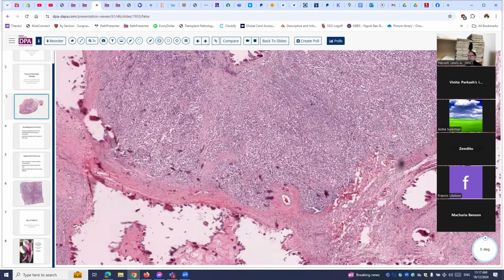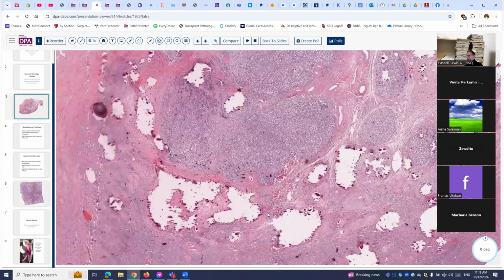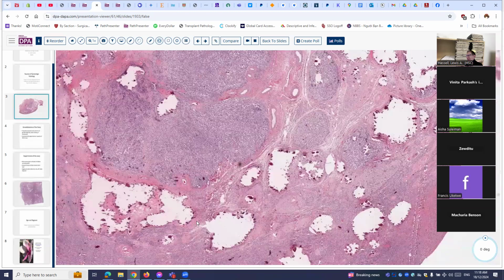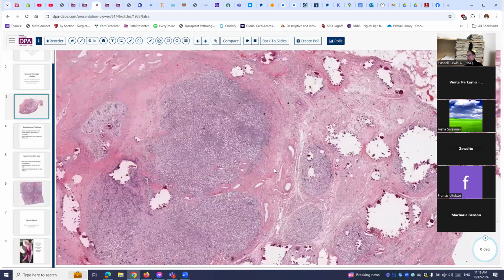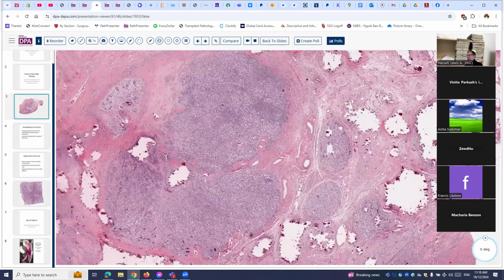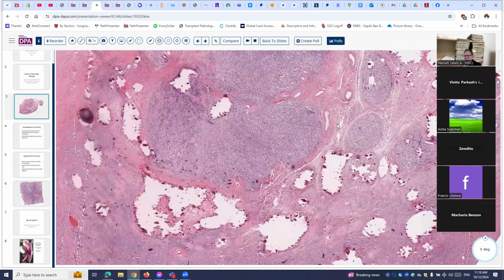Yes, you are right. That's the history. Now it's coming back to me. It looks a lot like dysgerminoma, that's all dysgerminoma, but I was thinking that the gonadoblastoma often calcifies, and so finding a viable tumor is often a challenge. So I was thinking that that's what the calcified areas might be. Yeah, I think you're right, and that's exactly right. And that's how the case came together.